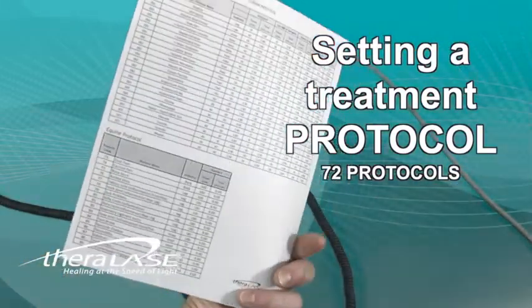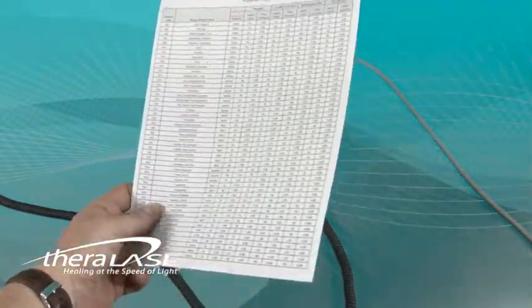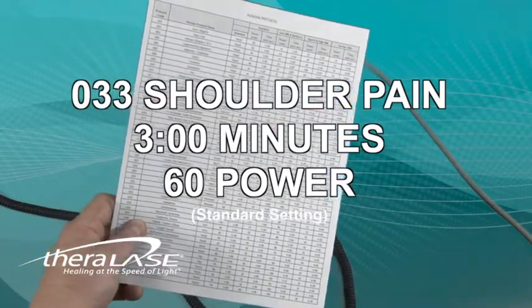Taking a look at the protocol sheet, we see 72 protocols that are listed in order from head to toe. Let's set the protocol to treat shoulder pain, which is listed as number 033.